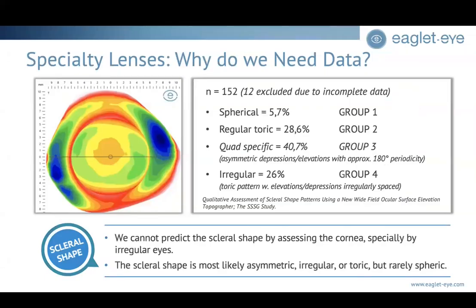Now, data has come a really long way as well. When we look back at where we started with scleral lens fitting, for example, because a lot of us, when we think about profilometry and complete measurements of the ocular surface, when we look at maps like you see in this picture, scleral shape, we're thinking scleral lenses only. I want to go through some cases in this seminar just to show that sclerals are not the only type of lens that we use profilometry data to fit.